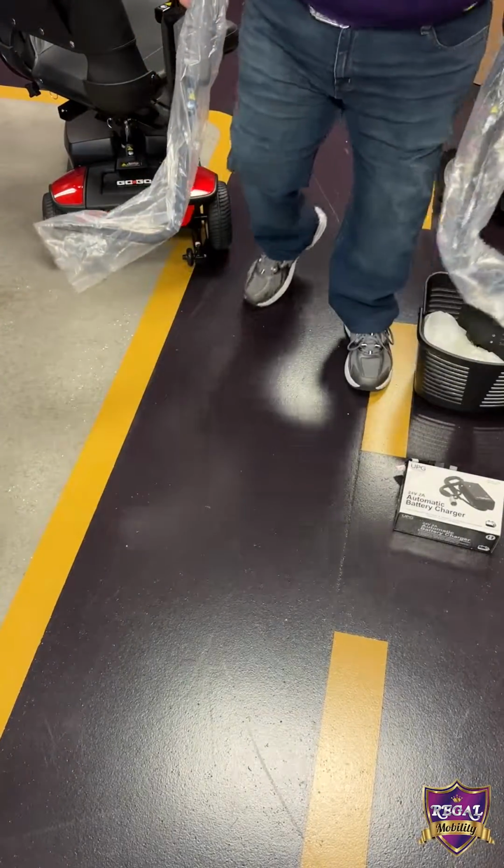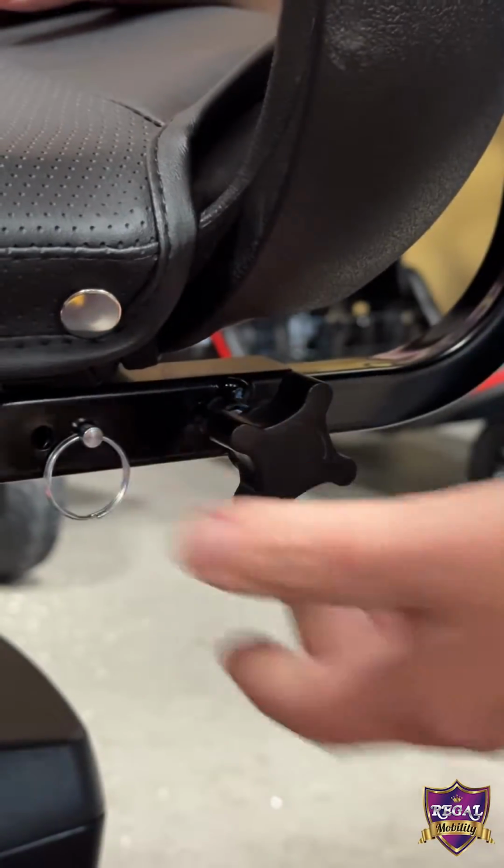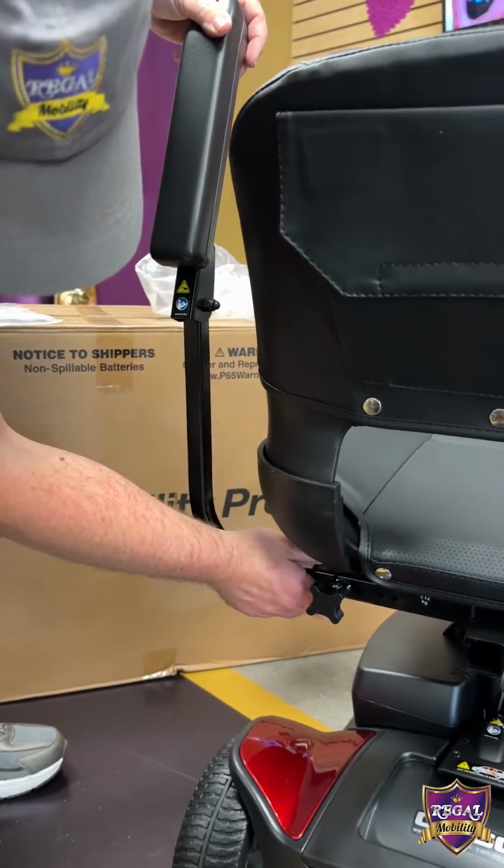Grab the two armrests and insert them into the brackets on each side of the scooter. Now locate the smaller of the metal pins and insert it into the bracket before tightening the knob to lock the arms in place.